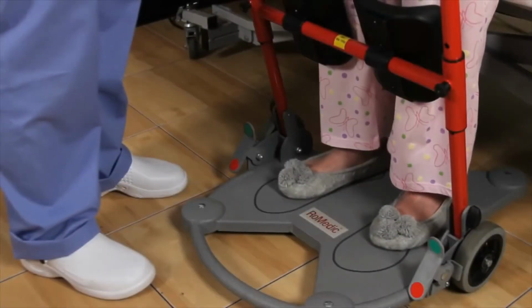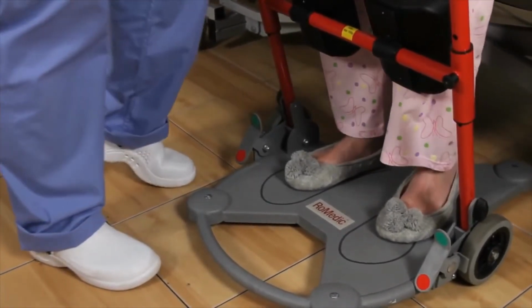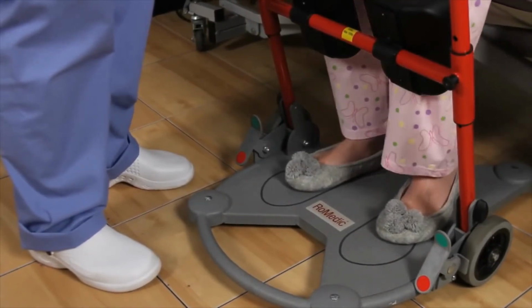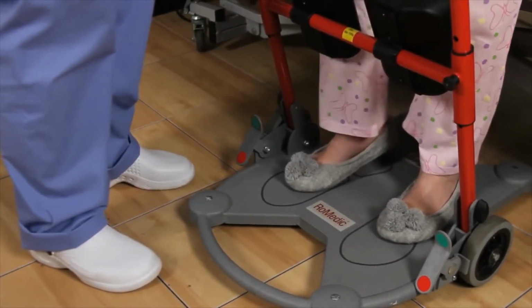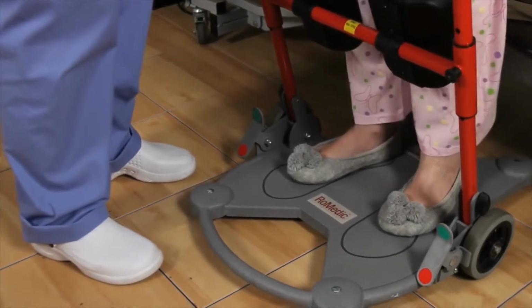When walking, we lift the heel before taking each step. In this test, we will assess the patient's ability to lift their heel to take a step. Ask the patient to lift their heels, left, right, left. If they can, then proceed to the lifting foot test.